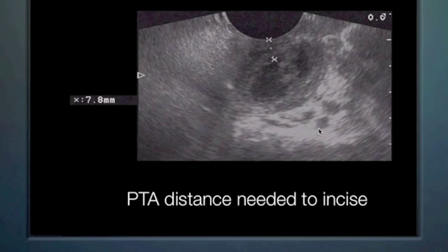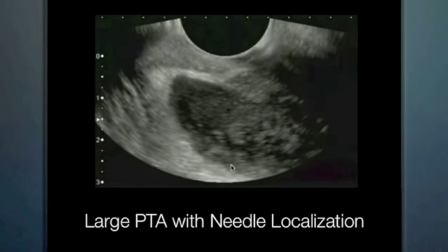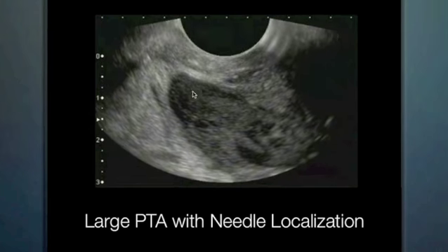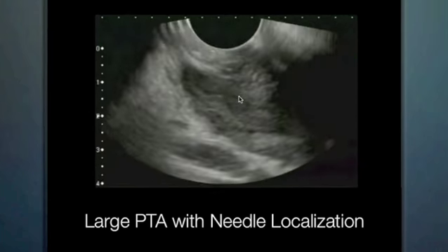And this is a large peritonsillar abscess. We can see it extending all the way down here. As we compress the back of the throat, we can see this is all pus. As it moves, as we compress it, it swirls around a little bit.